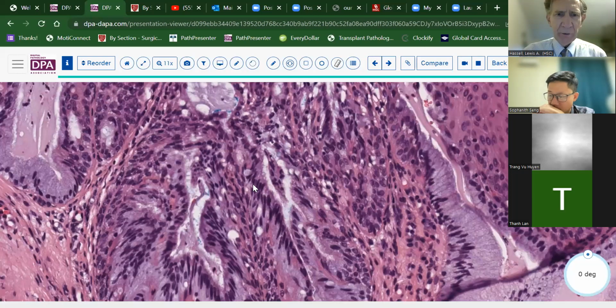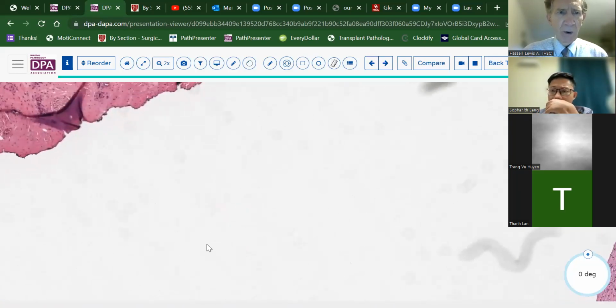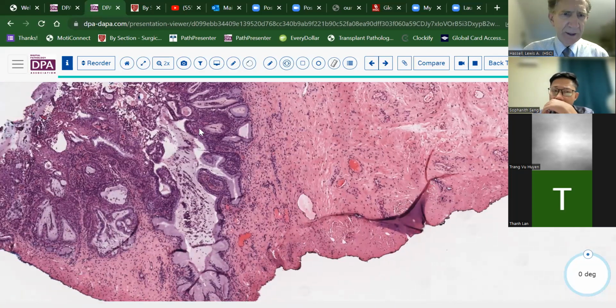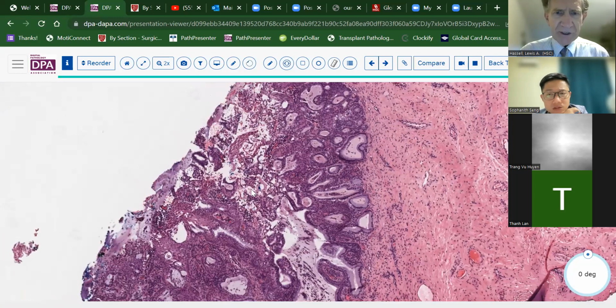Again, this was early on a mimic of endocervical adenocarcinoma. We now recognize it as probably a hormonal-related physiologic change. Here at low magnification, probably this area right here is what we would term microglandular hyperplasia. Now, there are many better examples of this, but this had both of these lesions together. And so I wanted to do this as a two-for-one type of exchange.